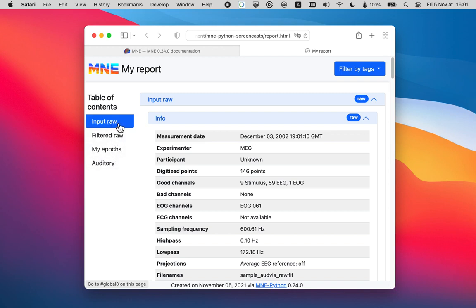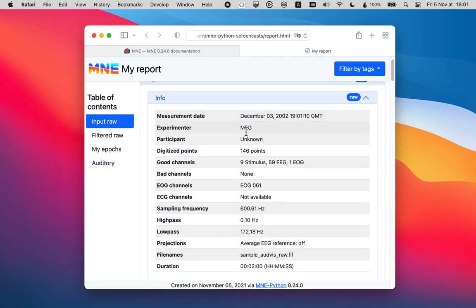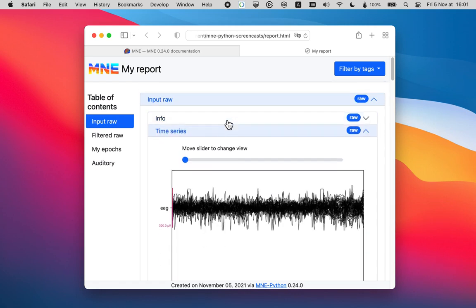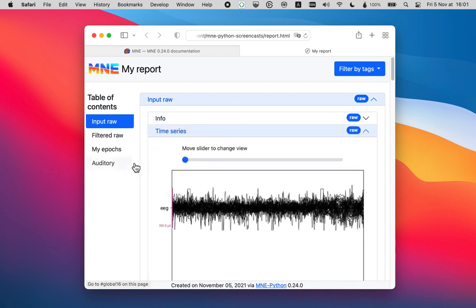So first the input raw, then the filtered raw epochs, and then the evoked auditory object. So what do we have here is some general information on the raw data that we added. To collapse this, I can just click the title here, and this collapses.